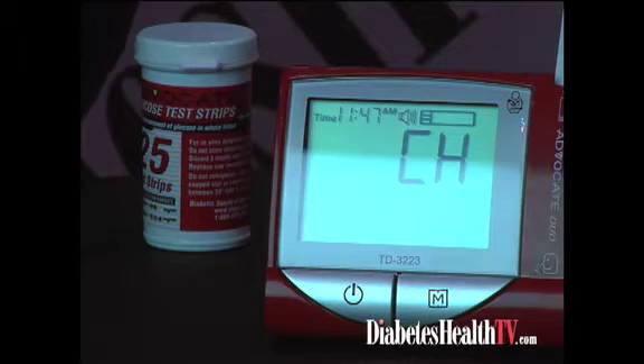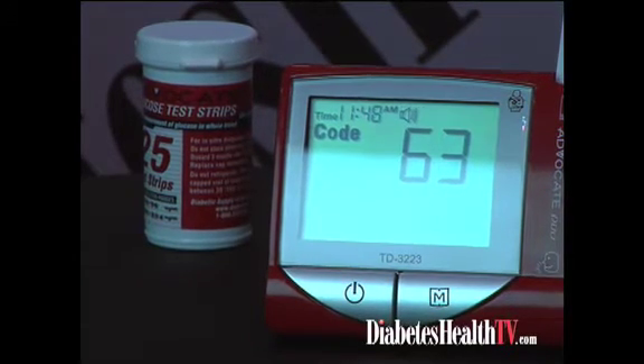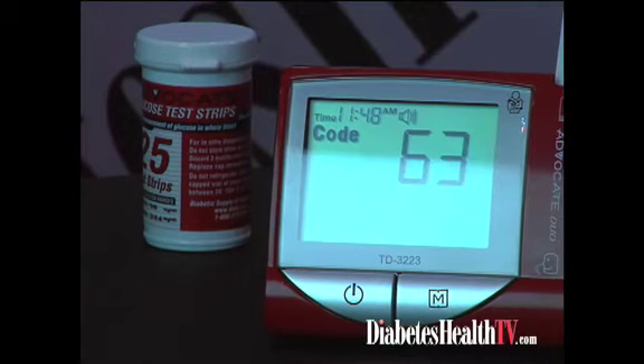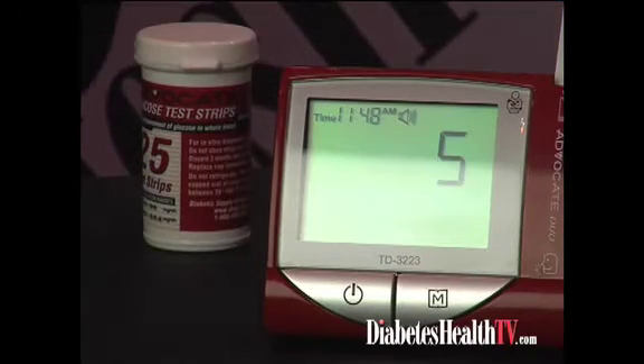Thank you for using this product. Please relax during measurement. The room temperature is 79 degrees Fahrenheit. Control number 10, 63, 63. I bet you can hear that better than me, John. At this point it will indicate to apply the blood. It gives plenty of time to lance yourself, take the blood, and put it on the tip of the strip, and it will absorb and read in seven seconds. It only requires 0.7 microliter of blood.